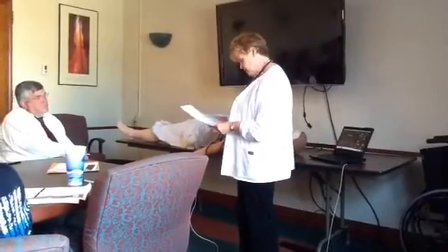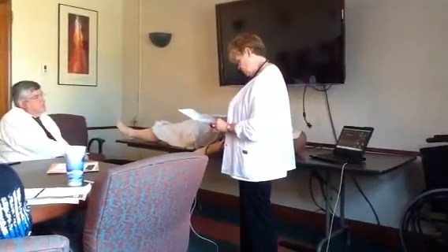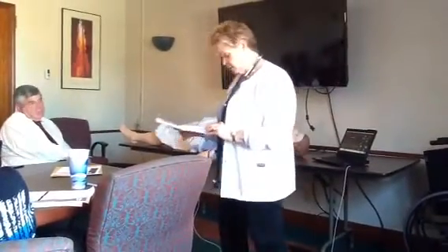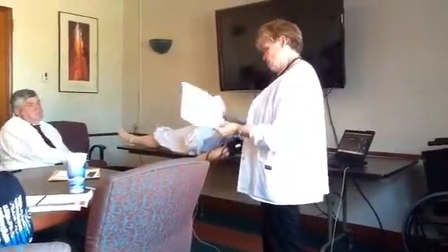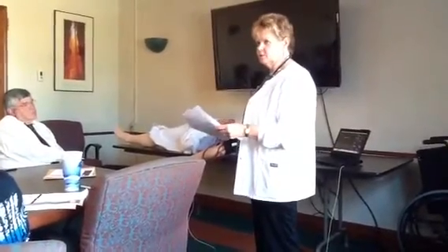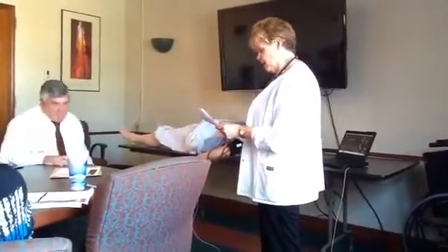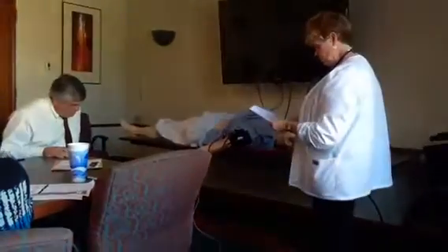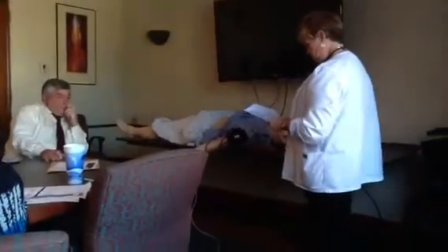He can have stomach distension. He can be intubated orally or nasotracheally. And he can have a chest tube, which we don't see a lot of chest tubes, so that's kind of cool. So we could really simulate that for competencies. He can have laryngospasm. Spontaneous breathing. You can change his respiratory rate. He can breathe faster, slower. He can have audible wheezing, all that.